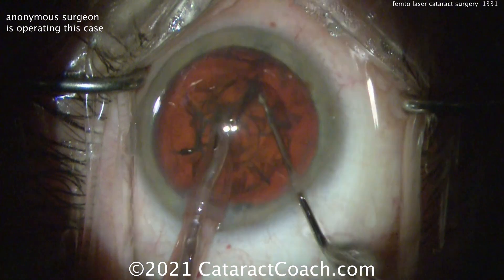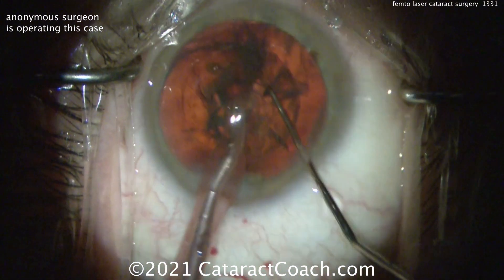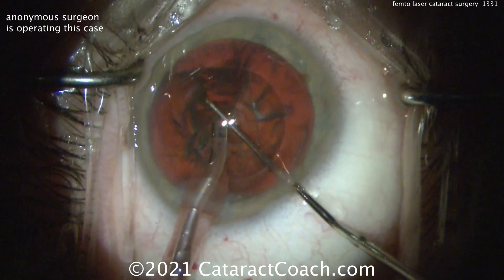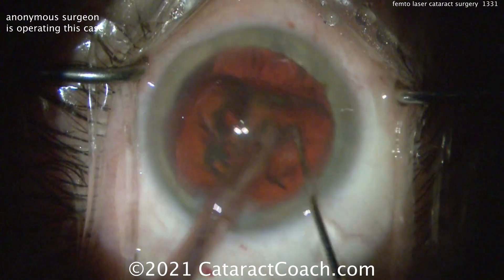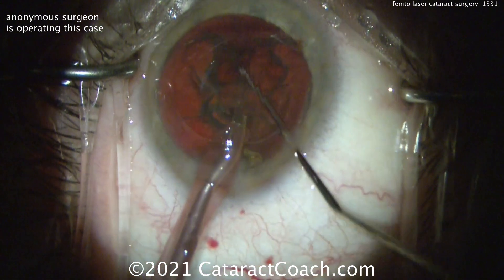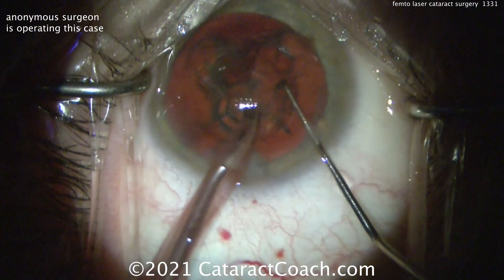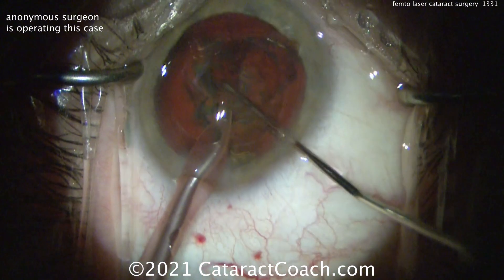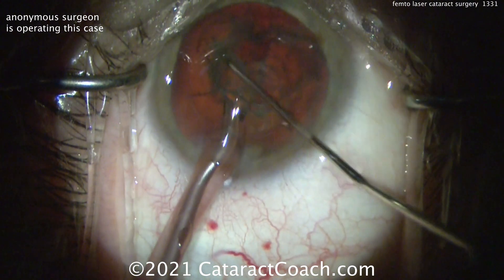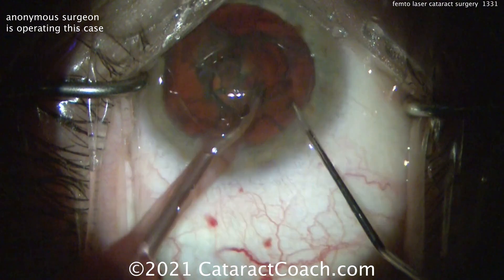Can these pieces just be split apart? Yeah, there you go. So now further propagating those division lines. Remember, the laser is not going to create this division all the way back to the posterior capsule, because you need some margin of safety there. So it's going to do it more in the center of the nucleus, anterior to center, and maybe a little bit towards the posterior capsule — but never right up to the posterior capsule for fear of putting laser energy into it.